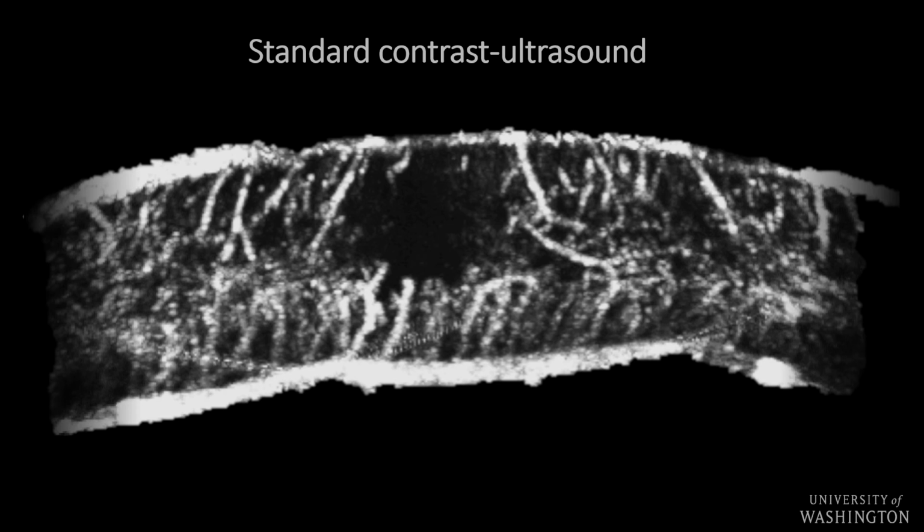We formulate a model, we derive the iterations of the optimization algorithm for that, and in this case we use the LISTA algorithm for that. But what you see on this slide is the standard image, and when I move to the next slide you will see what LISTA, the learned iterative shrinkage and thresholding algorithm based on that model, does.